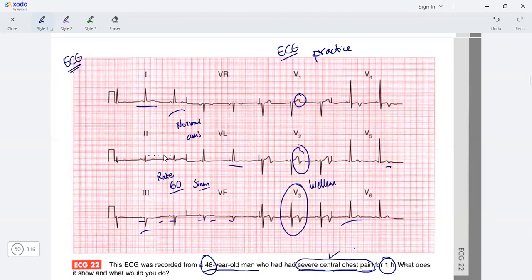The biphasic T wave in the anterior leads V2 to V3 indicates anterior ischemia. This is known as the Wellens pattern. Let's check out what Hampton says.